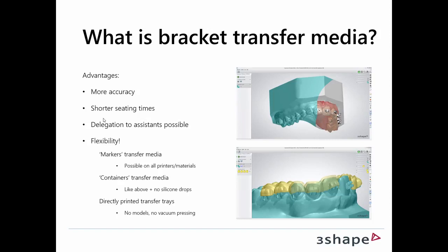Sounds like a good idea. It also means that you'll be able to maybe delegate this to some of your assistants, depending on which country you're in and the legislation. It offers a very high range of flexibility. So if we look at what we call markers, that's a way where you can find a way to represent where the real bracket should be placed later on a model you thermoform on top of.